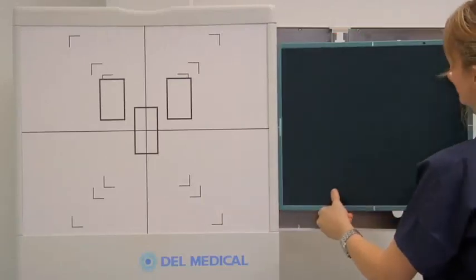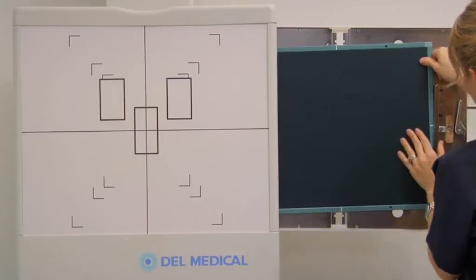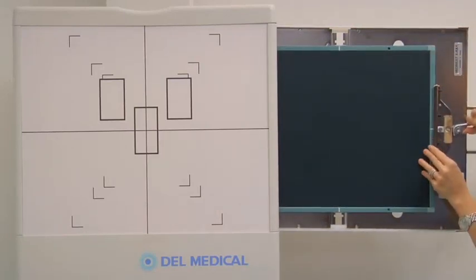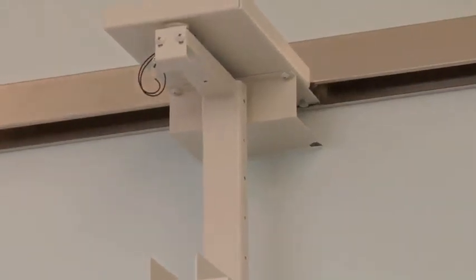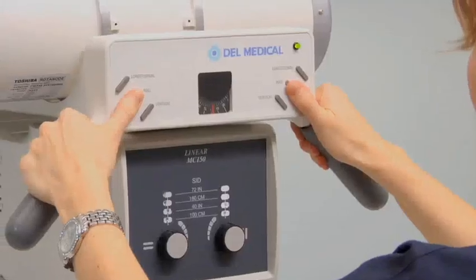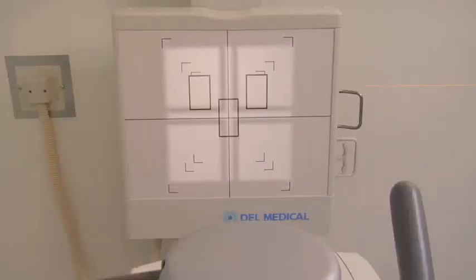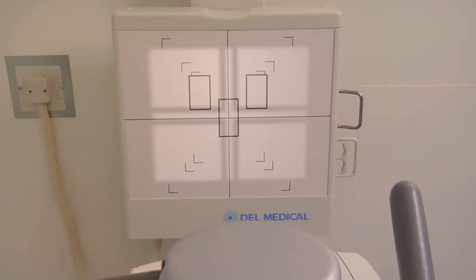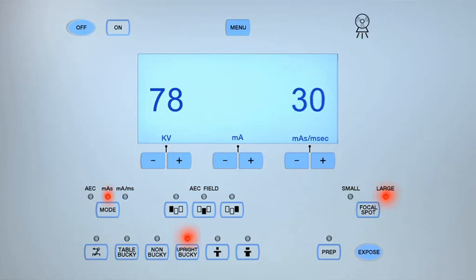To obtain a radiograph of the abdomen in the lateral decubitus position, begin by selecting a 14 by 17 inch cassette and placing it crosswise in the upright bucky. Ensure that the SID is set to 40 inches. Line up the central ray perpendicular to the image receptor and collimate to the cassette size. Select the upright bucky setting and the large focal spot on the machine. Set the exposure parameters to between 75 and 80 kV and between 25 and 35 MAS.